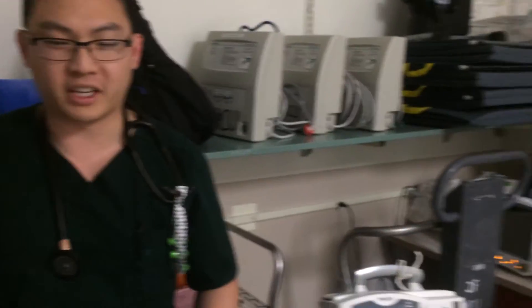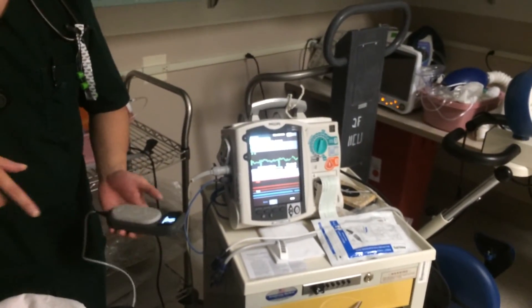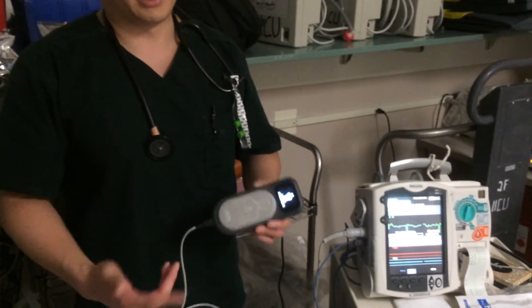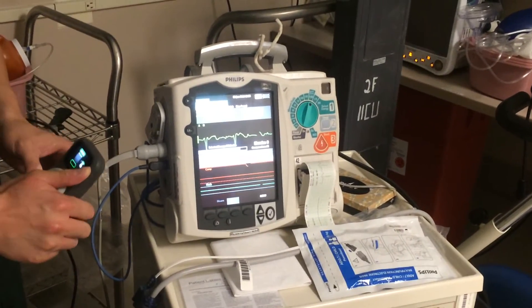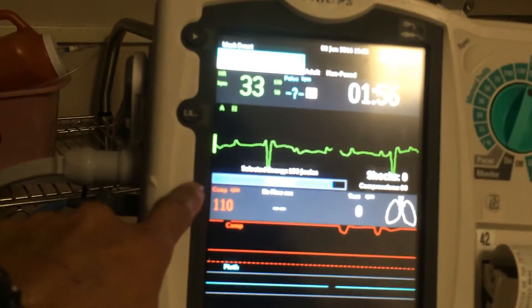An important note: for filming purposes I'm on the same side as the defibrillator, but ideally I would be on the opposite side so I can see the feedback. There is feedback in the puck itself, but it is a little easier to see the monitor and get a better idea of compression quality.